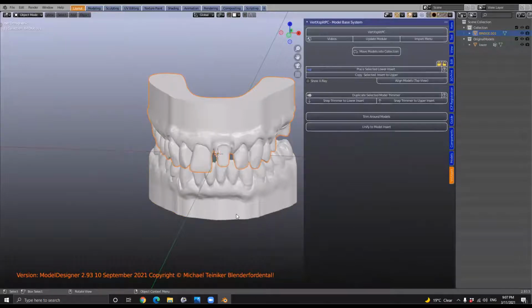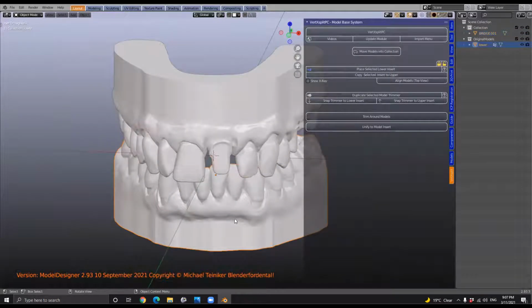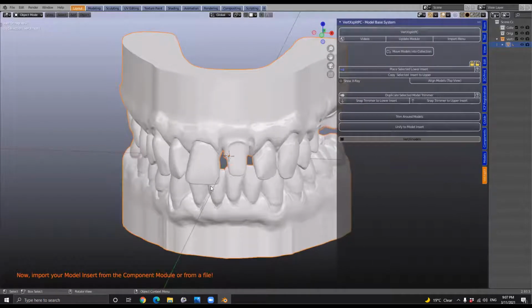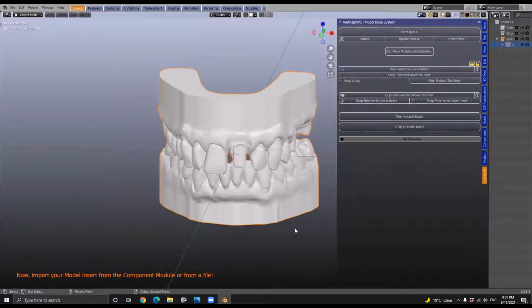So if you've got one model, you'll select one. If you've got two models, shift left click to choose the other one. And then we're going to move the models into collection, and it's moved it into the vertex model collection. And note that they are linked up now. The orange line goes all the way around it, so it's linked up.